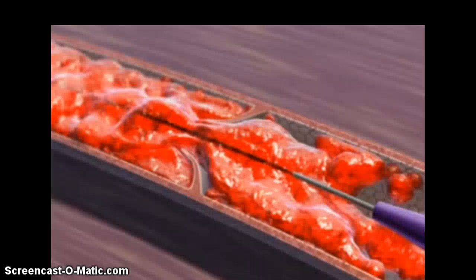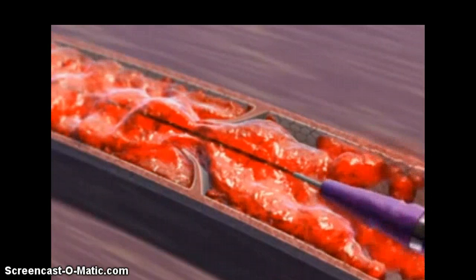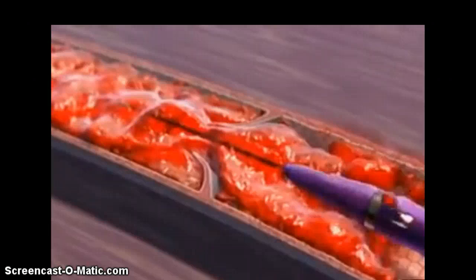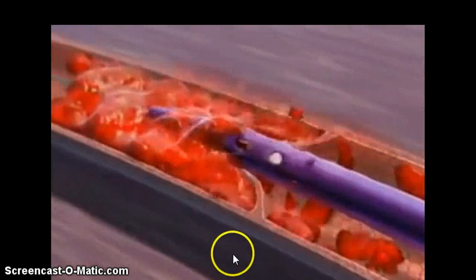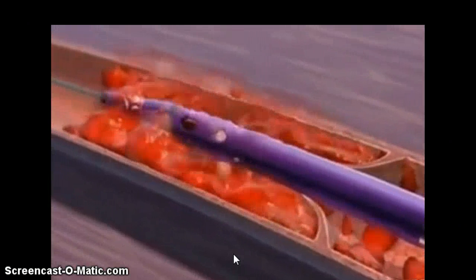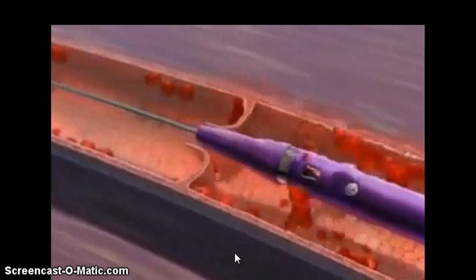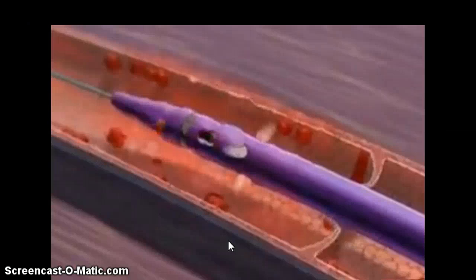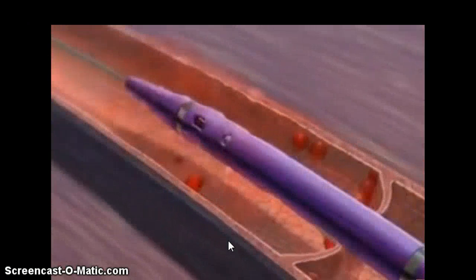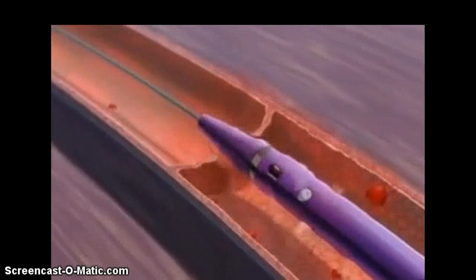Here is a video of the AngioJet. It's hooked up to a machine, there are lots of moving parts, it's kind of noisy, and it's very electrical. You can see that it does this water jet thing to create a vacuum to suck out the thrombus.